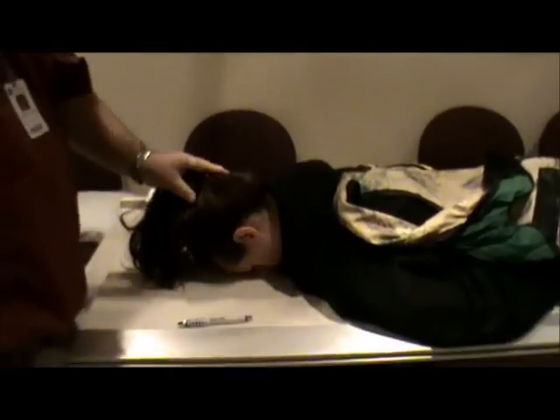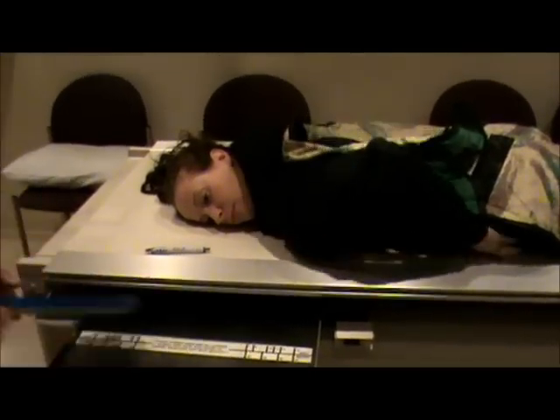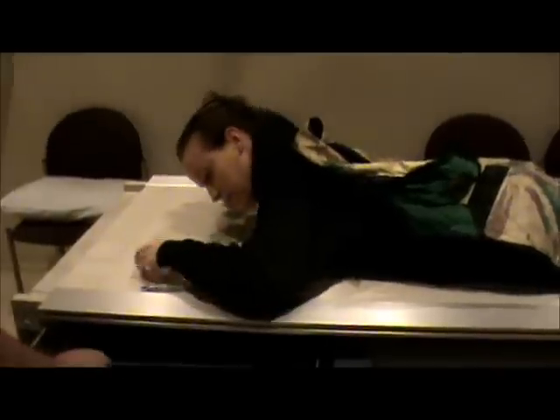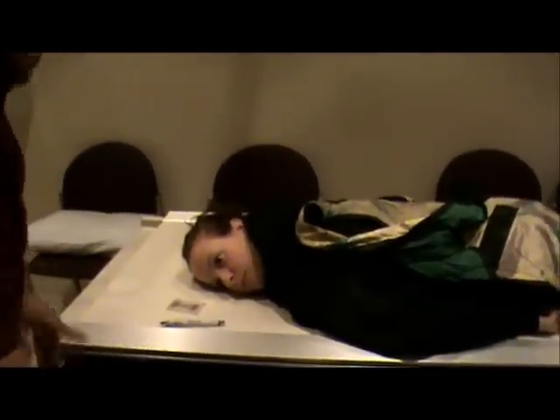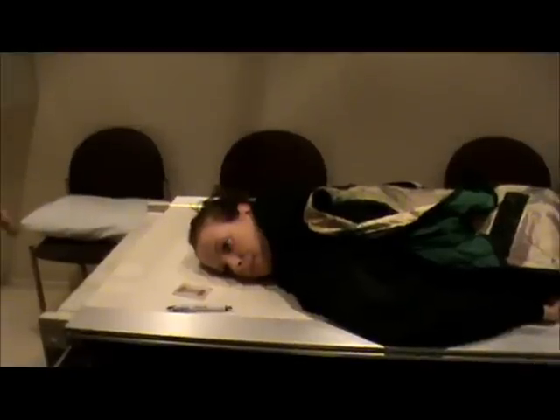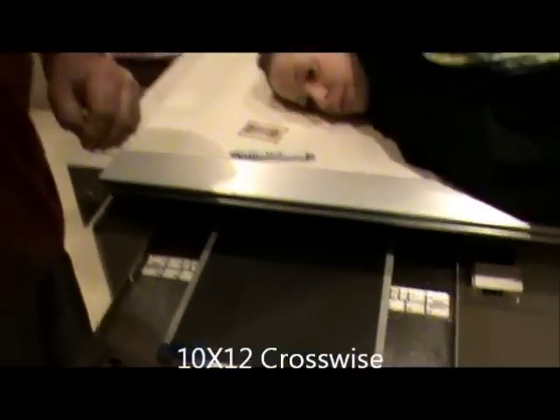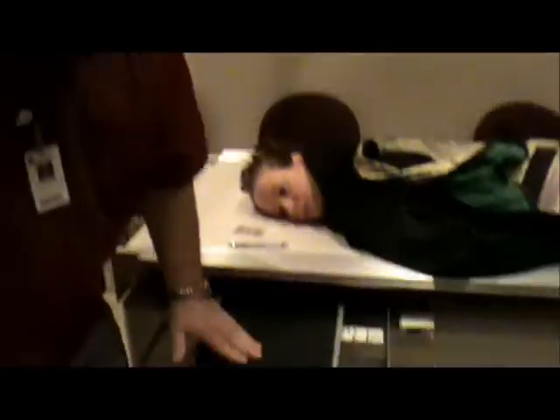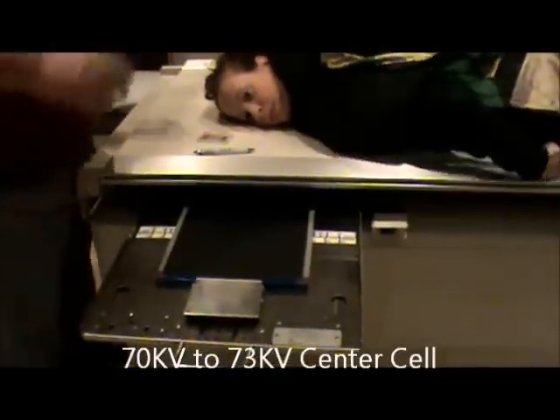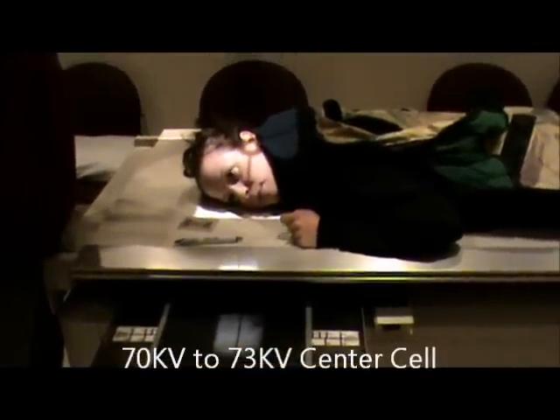We're going to have the patient turn and put her right side against the bucky. The technique for the PA and AP was 77 kV. Now for our lateral, we're still going to use a 10x12 but turn the film crosswise. Our technique will be 70 to 73 kV, still center cell. I'm going to center it up to my bucky and make sure I'm center locked after turning the film from lengthwise to crosswise.